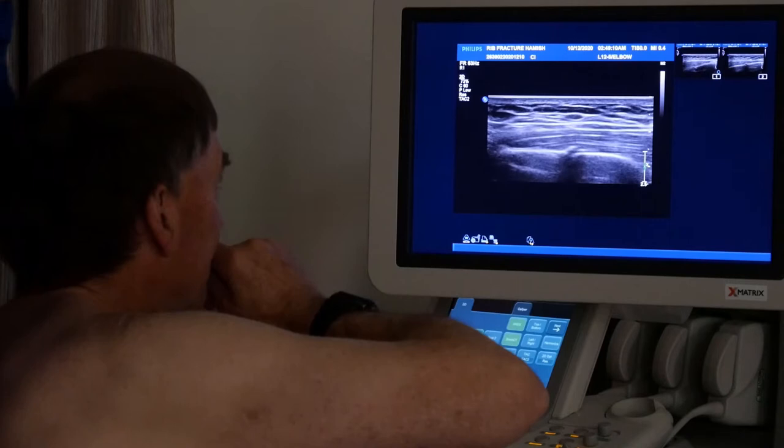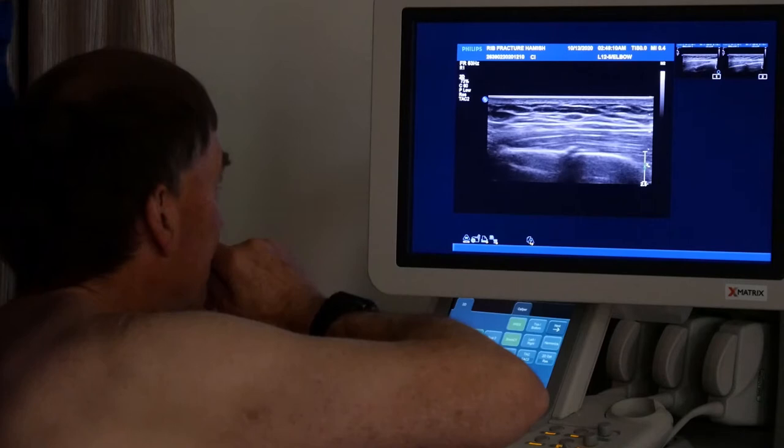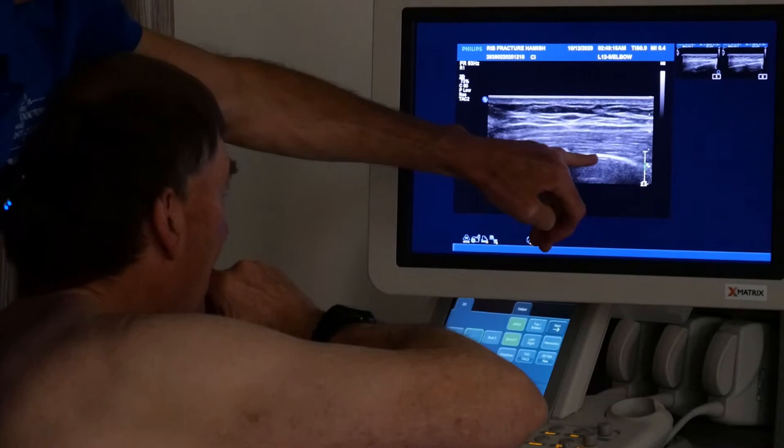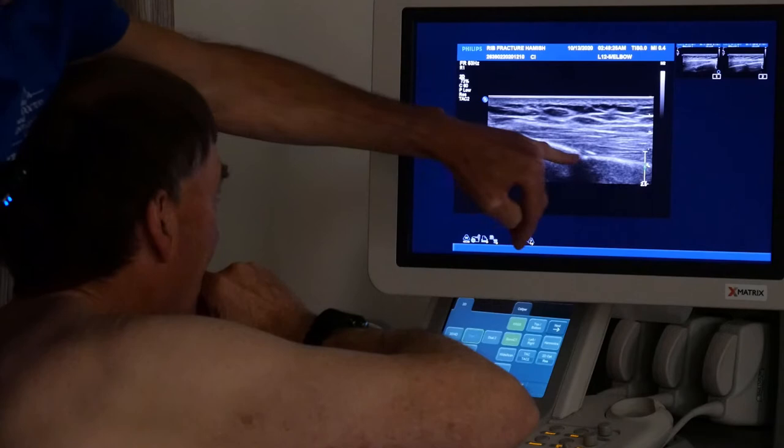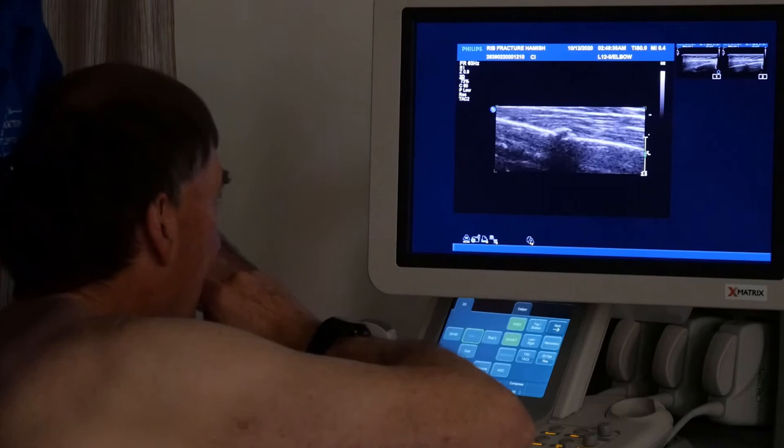There we go - we're right on the fracture, and you can see that kind of immediately. So this is a rib, with muscle on top and skin up there. We can follow the ribs along like that - follow it along and then you see an interruption. That's pretty obvious. We can make it bigger if we want to - there's the fracture.